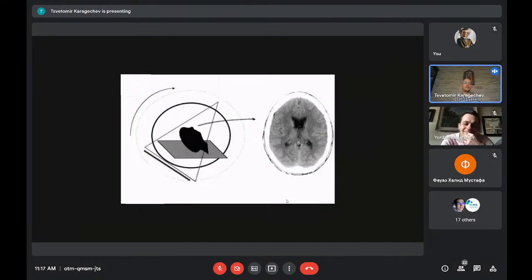Before we start, I promise you all that we won't dive deep into physics during this talk. I will present the basic technical principles as simply as I can. So what is important? The CT scan is an X-ray machine. It uses X-rays. Unlike MRI, there is an actual radiation effect on the patient. There is an X-ray source. It produces an X-ray beam that goes through the patient. It reaches the detector as they spin around the patient. And then some fancy physics and some fancy computer programming happen. The end result is that we get a cross-sectional image.